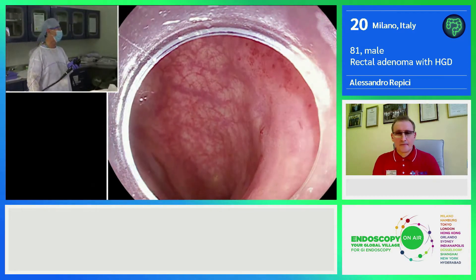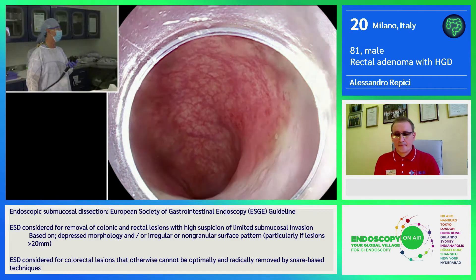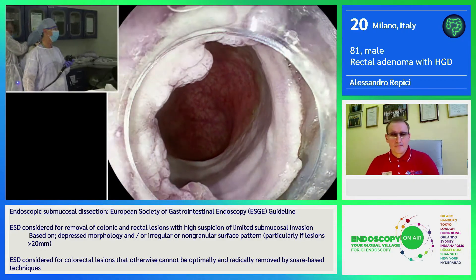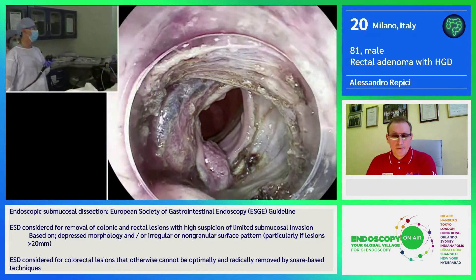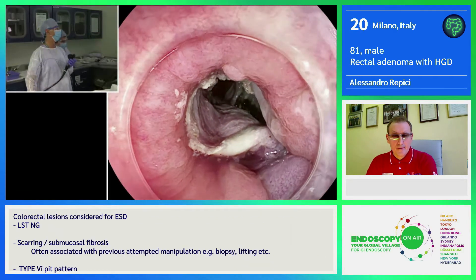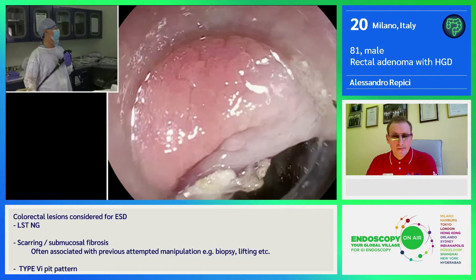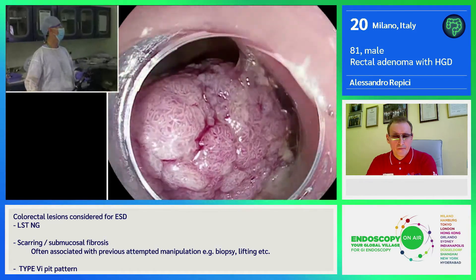You see this? Before she takes over again, let me see what she has done. I see here a cut. She is already tunneling this lesion that was starting almost at the anal verge. You can see a big bulky lesion.